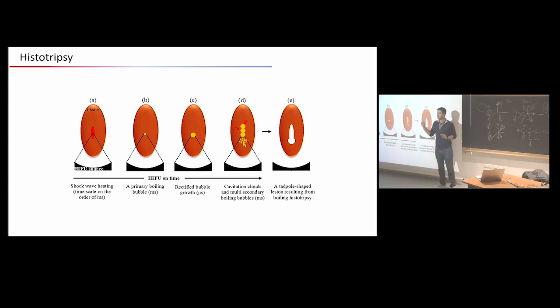And a bubble, if you remember the lecture yesterday, it's a very good contrast agent. It's very sensitive to ultrasound. And the fact is that you're transmitting so much pressure on your bubbles that you are going to fragment your bubbles. And when you're doing bubbles fragmentation, you just destroy everything around.